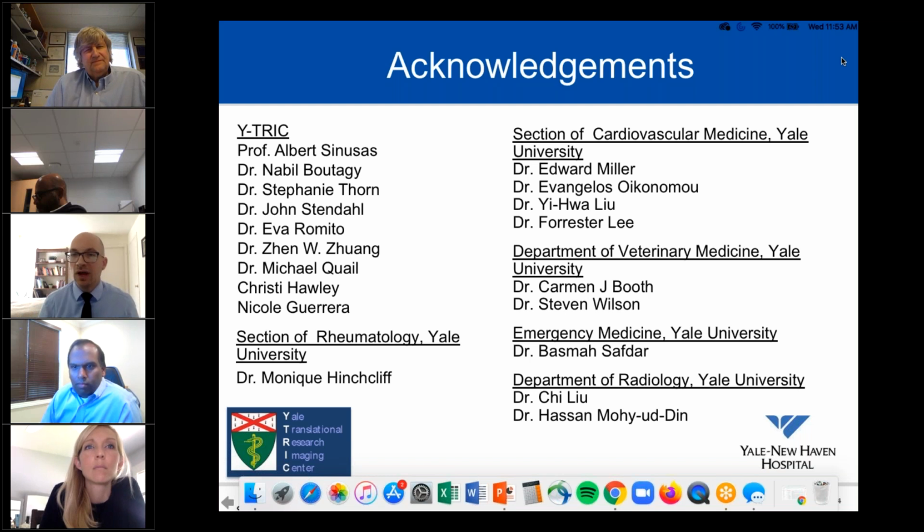So I think there have been a few publications from the Cleveland Clinic group and from another group that dobutamine stress echo is really not a perfect tool. I see that some centers don't have PET, and if you don't have PET, you have to use something to monitor these patients. So it's a reasonable option to use dobutamine stress echo or SPECT, but there have been some publications with concerns that dobutamine stress echo showed some false negative results. Patients had allograft vasculopathy in the presence of normal stress echo.